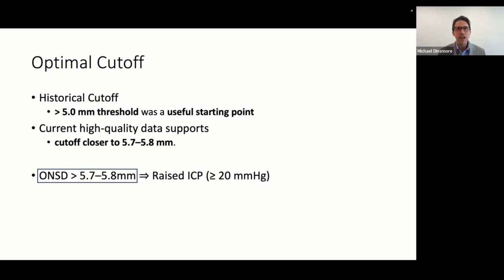Now, again, I just want to say that it's important that you don't just measure one specific measurement and that's it. Okay, you really want to do this over a time range. I think that's important because some people can just have a big optic nerve, some people can have a small optic nerve. Okay, so you need the person as their own baseline.